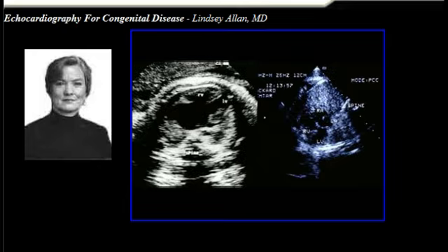This is another example of an atrioventricular septal defect over on this panel here. In this case, the fetus is lying with the spine up towards us, but you can still see well into the fetal thorax, and the apex is down here. Again, it's a common AV valve bridging an atrioventricular septal defect with an atrial and ventricular component. But in this fetus, there is what I would call right atrial isomerism.